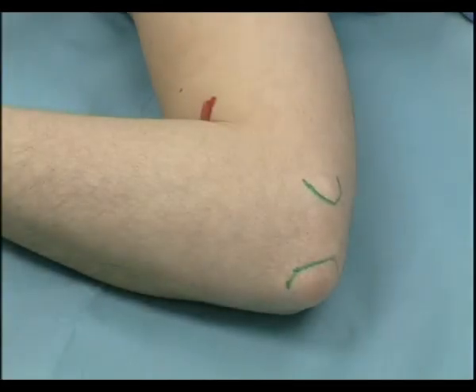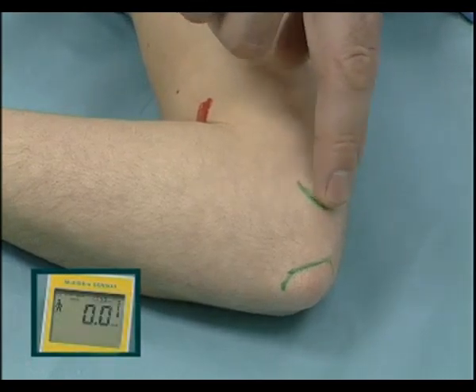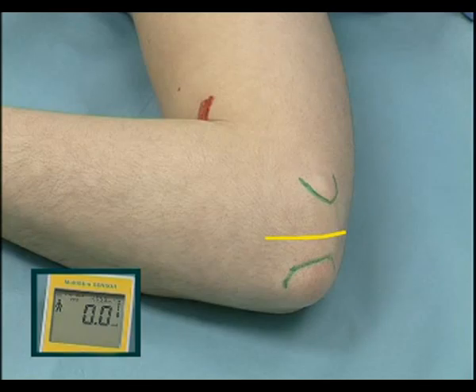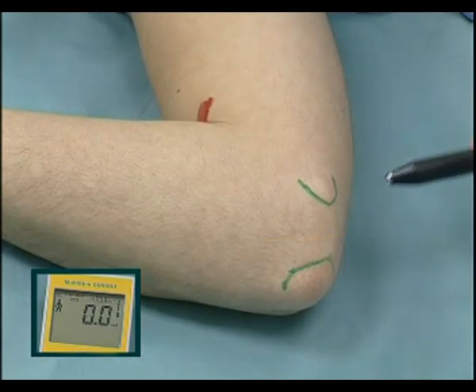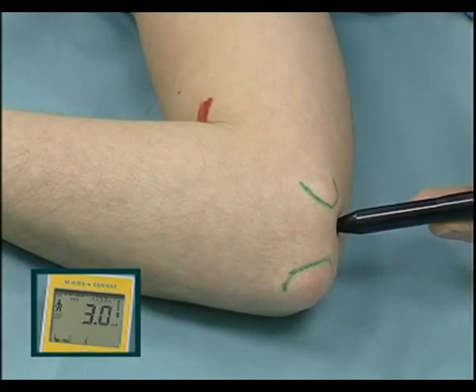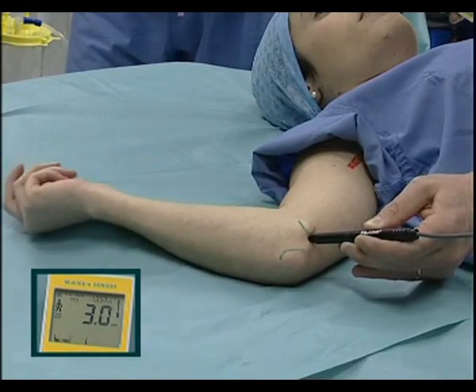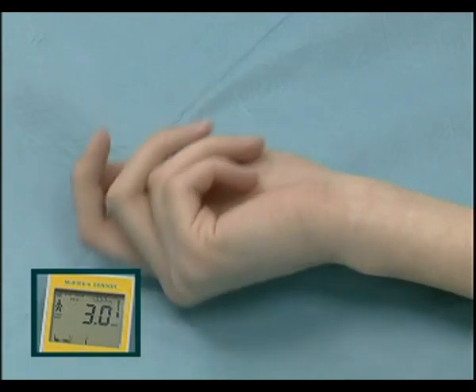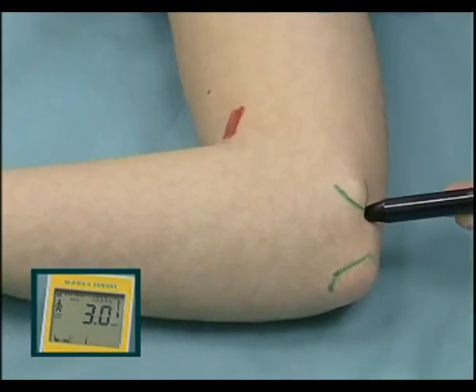Ulnar nerve. At the elbow, it lies in the sulcus between the medial epicondyle of the humerus and the olecranon. Paresthesia is rare. Motor response causes wrist flexion and stimulation of medial finger flexors and adduction of the thumb.